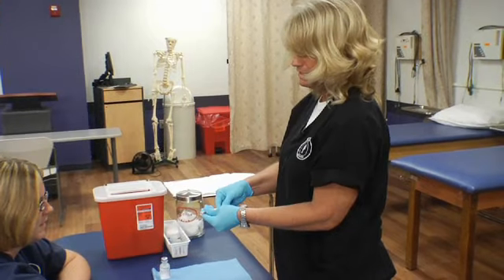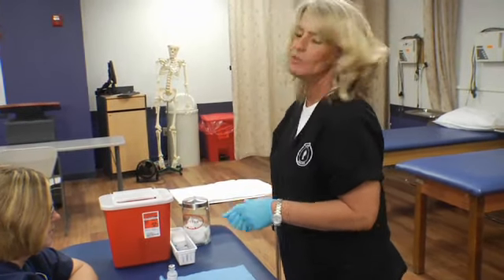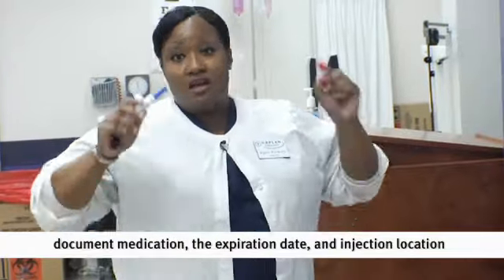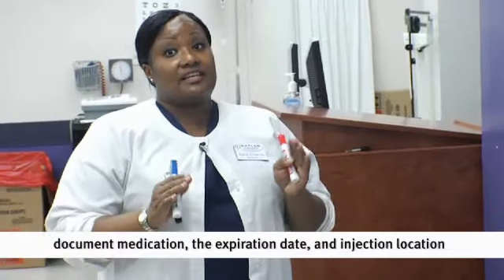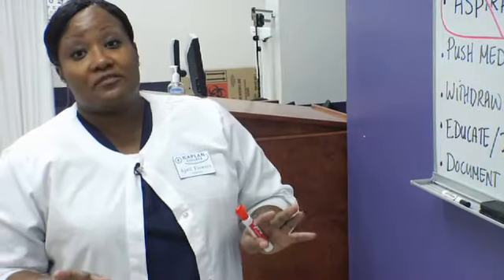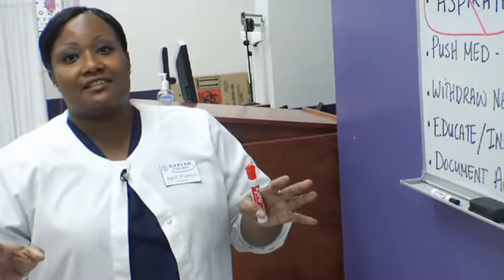We've just given the injection. We use the sheath and dispose in the sharps container. Then after you've done all of these steps, make sure you document accordingly — document the medication given and the expiration date. Documentation is key. Remember, if it wasn't documented, it never happened. If you don't get a wheal, it isn't a check-off. Don't feel bad — get your experience, get your practice in by coming to class every day.